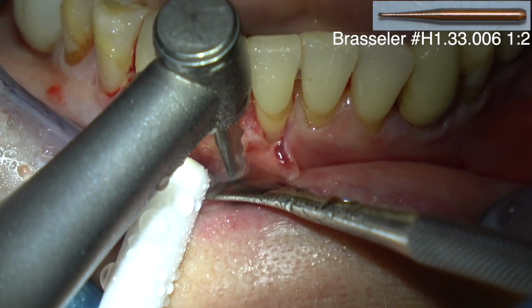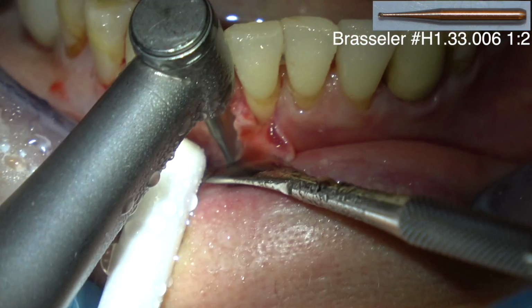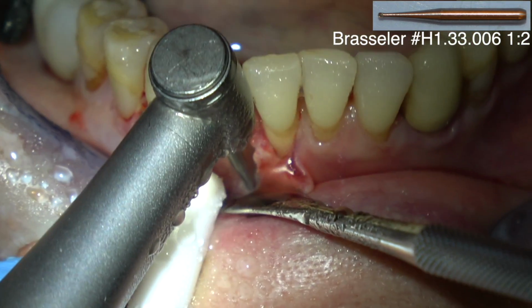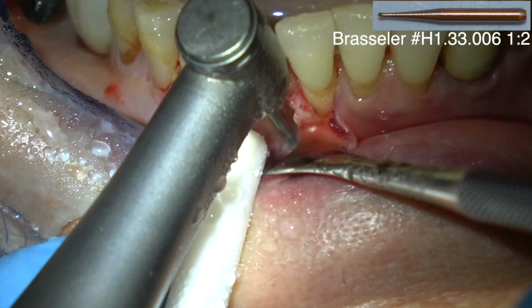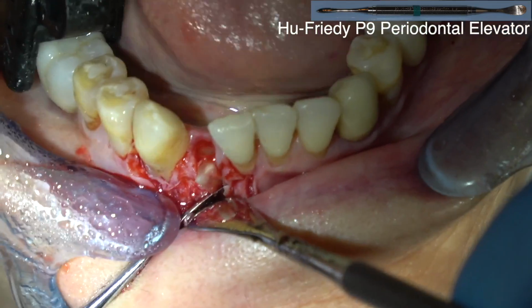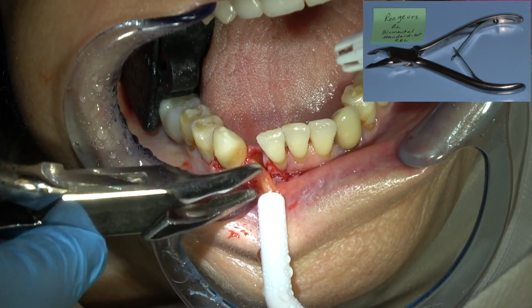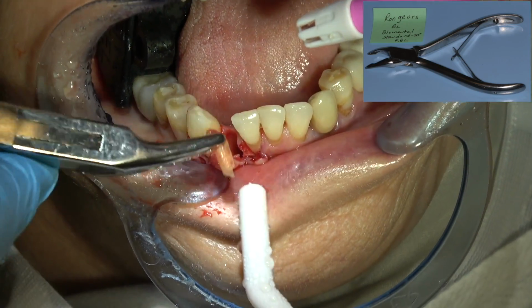You really ought to have some long shank round burrs in case you get into this type of situation. A normal shank round burr won't do it because you hit the handpiece on the adjacent teeth and it won't let the burr get far enough into the socket to do any good. So here it comes, root tip.